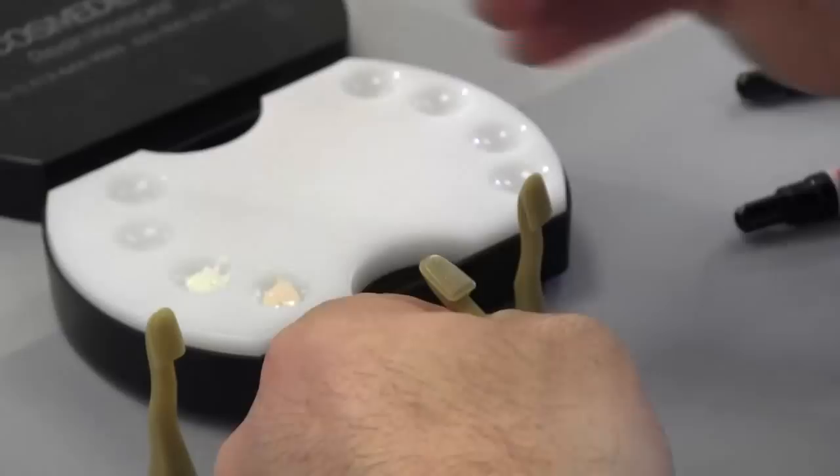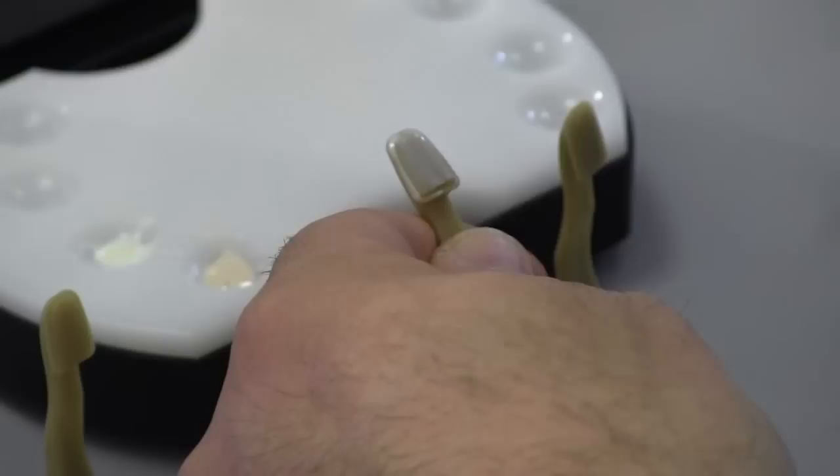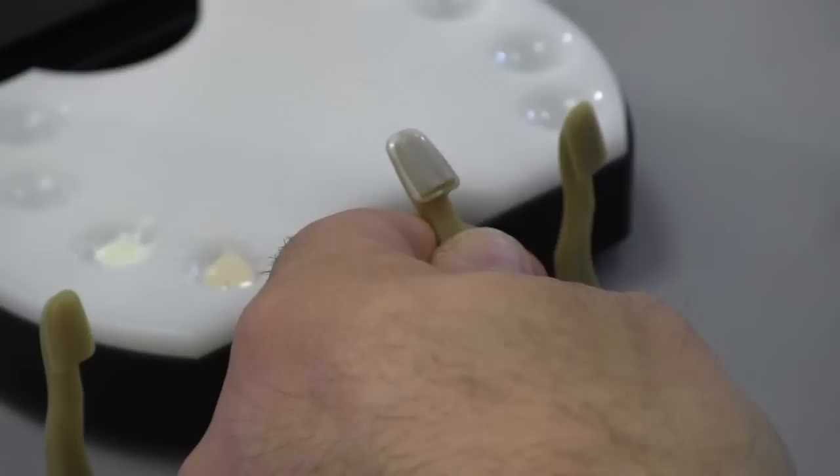If you notice, you can see the flatness and brightness of this opaquer. To come back from this color is very difficult, because once you put your composite over the top, it has a tendency to be either too bright, or white and brown can bring the value down of your restoration.